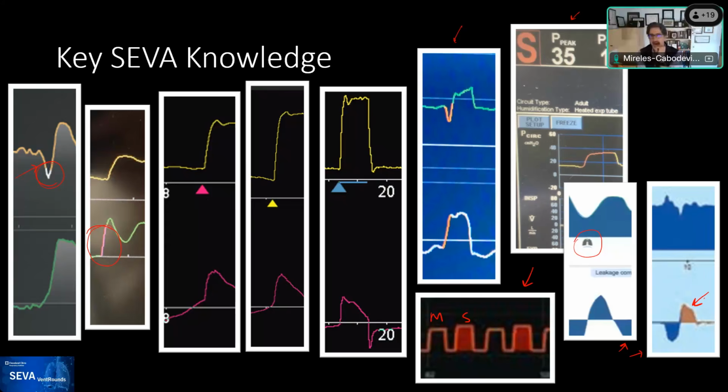Yeah, great points, Rob. Without a doubt, there are ventilators that, in part we're used to dealing with them, but you have to really know your ventilator and read up and sit with it and play to see sometimes where the marker is going to come and how it comes.